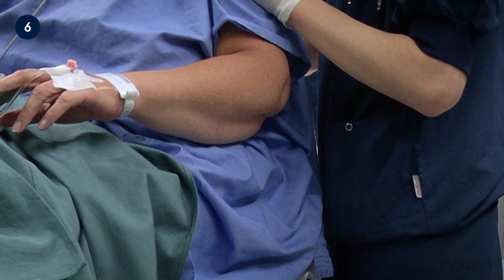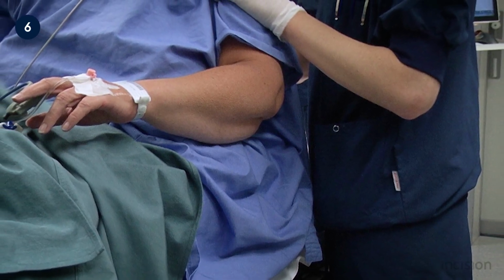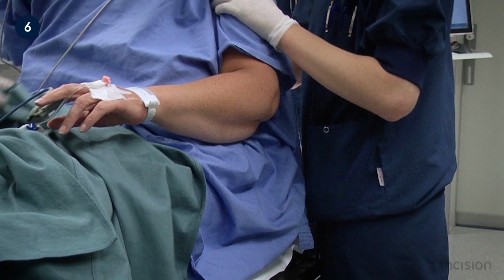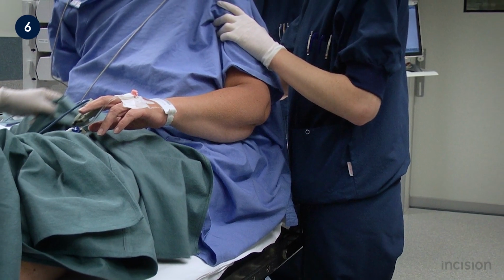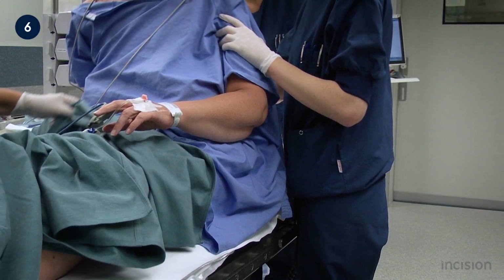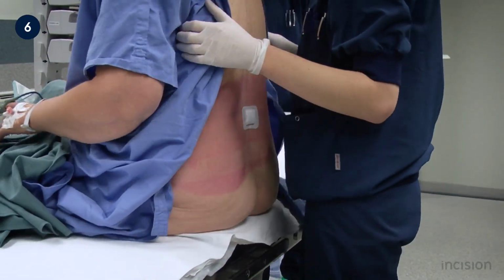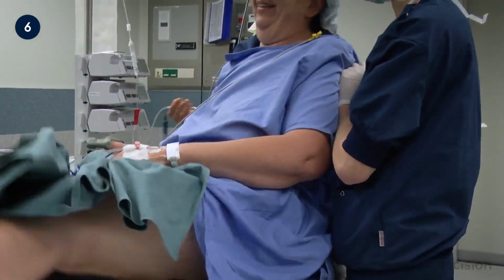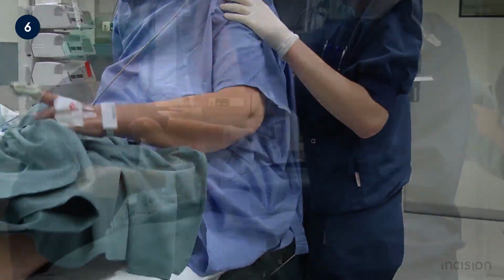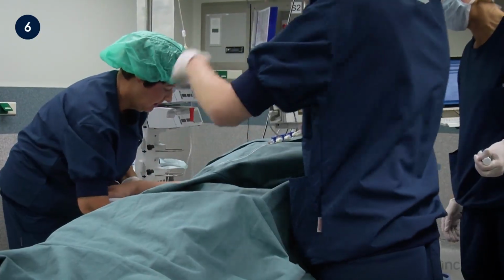Monitoring of blood pressure, pulse oximetry and ECG is mandatory throughout the spinal anesthetic. If non-invasive blood pressure is being used, the cuff should be on a 2.5 to 5 minute cycle in the first half hour of the spinal anesthetic. With the local anesthetic now distributed, the patient is assisted with lying down. Again, take note that lower limb paralysis places the patient at an increased risk of falling.